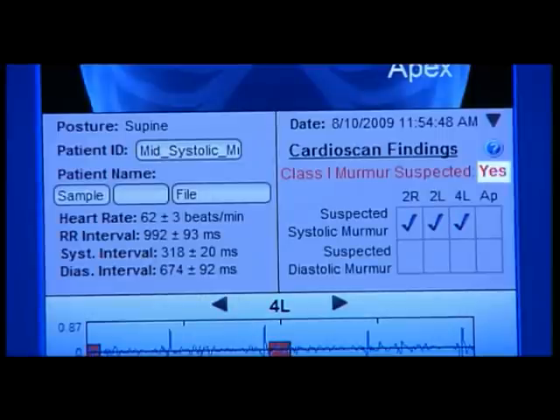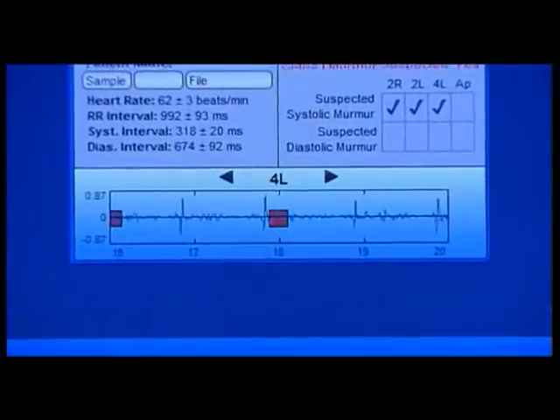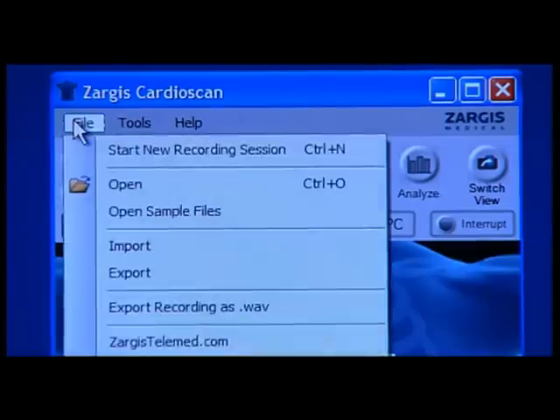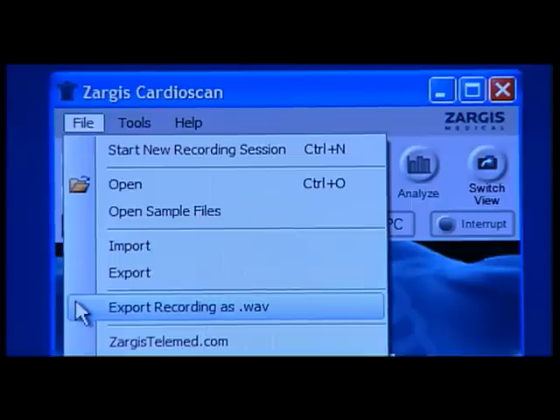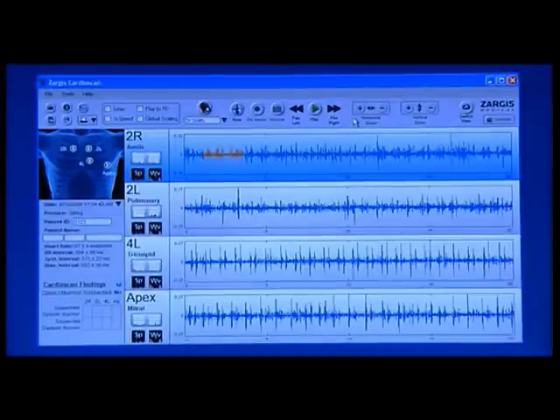Most importantly, look for yes or no to the right of the Class 1 murmur suspected statement, appearing at the bottom right of the summary screen. At the bottom of the summary screen, you will see the phonocardiogram of the selected recording site. The sound files can also be exported to a WAV file format, which can be played on most PC media programs, such as Windows Media Player. For a more thorough analysis of the recorded sound files and the Zargis CardioScan software analysis, click the Switch View button located on the upper right-hand side of the software screen.